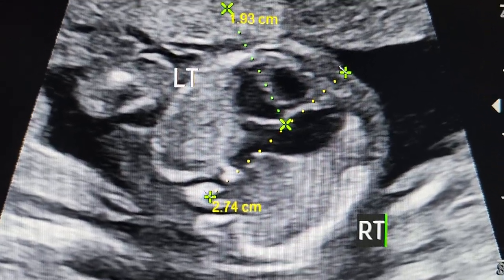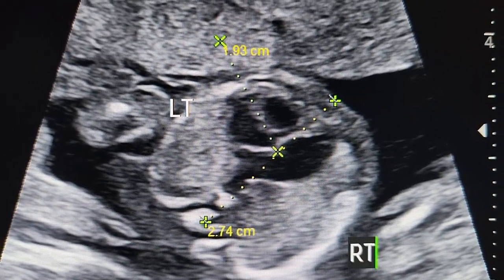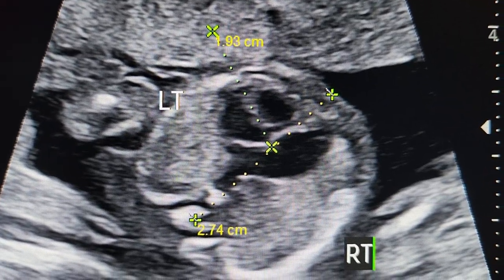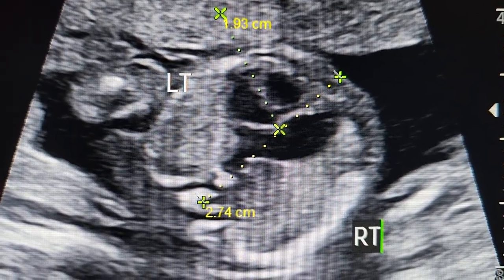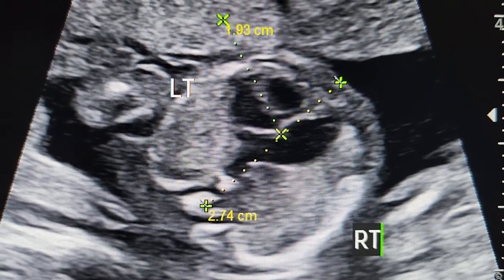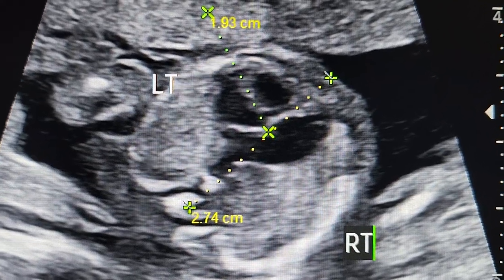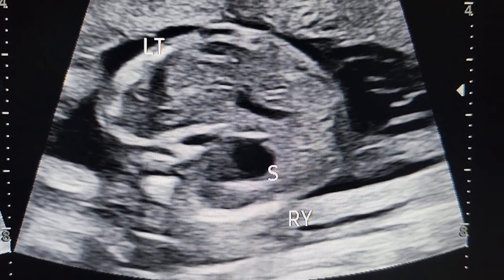To quantify the levocardia, we draw a mid-sagittal line from the posterior vertebra to the sternum; this would go across the mid part of the heart, which is the crux. Then we draw another line along the interventricular septum to meet the first line, so the angle subtended by these two lines is the angle of the axis of the heart. Normally it's about 45 to 60 degrees; here it's almost 70 to 80 degrees, so there is an increased levocardia.